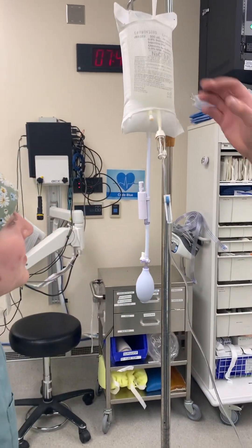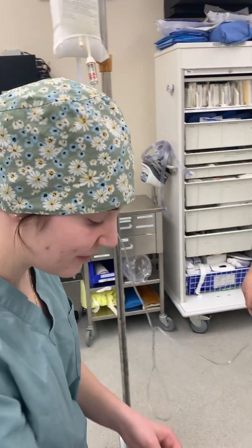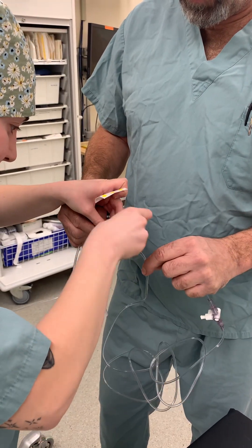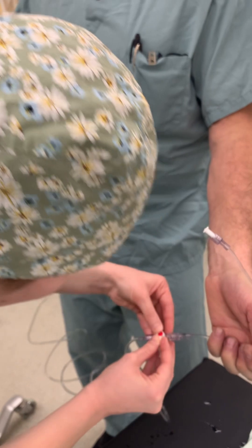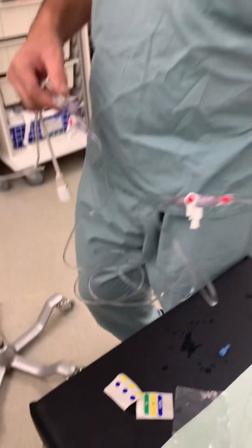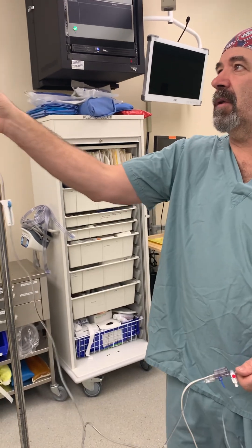Next step is to zero the art line. Before that, you want to always label the line so there's no confusion about what it is. You also have these red stickers — put one on each connection. The red indicates art line, the blue indicates central line, and the yellow is for swan — we don't really use that much anymore, I haven't used it in probably 20 years.